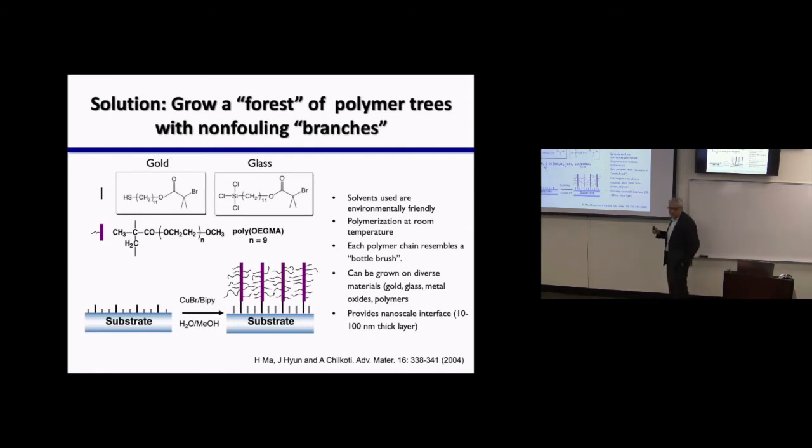So when I got into this field, it was well known that if you take a synthetic polymer called polyethylene glycol, most of you know PEG, it's actually everywhere. It's in shampoos, conditioners, it's even in mayonnaise, I believe. PEG is an inert polymer, so the body is supposed to tolerate it well.